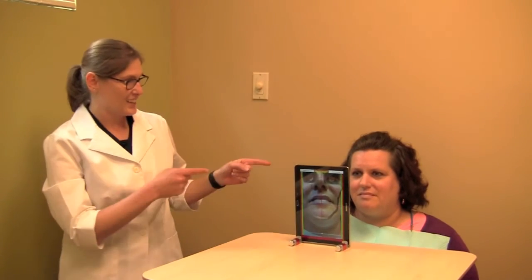One other key point that we find is if you have a taller table or countertop with an adjustable chair, it gives you a little bit more freedom to adjust the patient and Max together. So, Vanessa, retractor time.